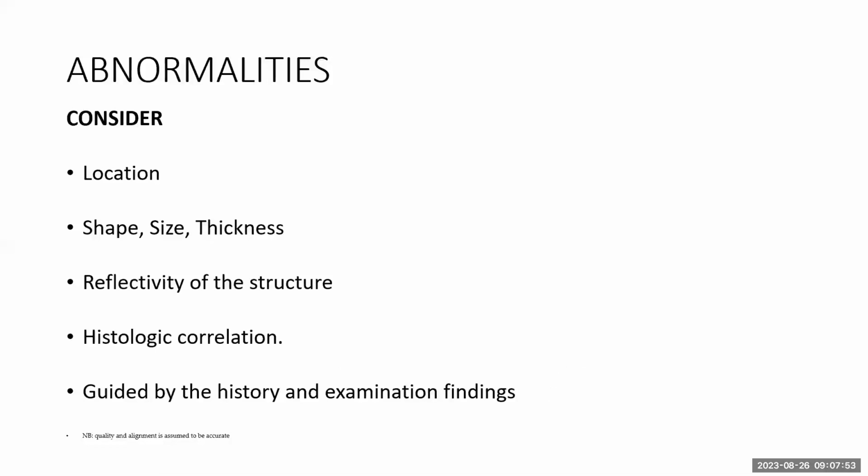A lot of OCT features actually are not a definitive diagnosis, they point to differentials. What makes the diagnosis is your examination findings and the history.